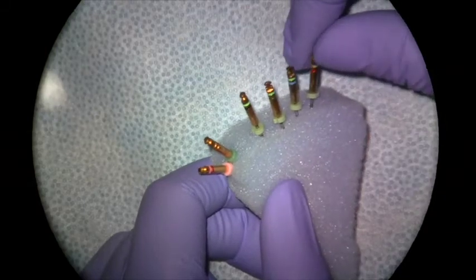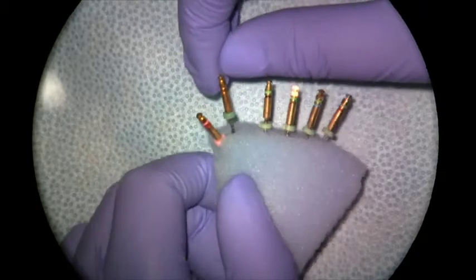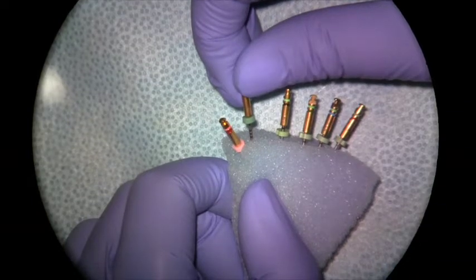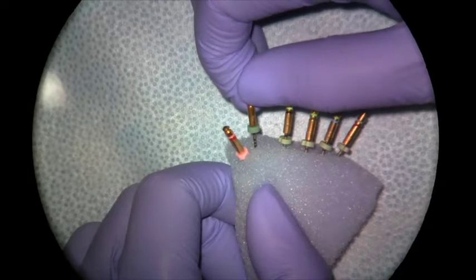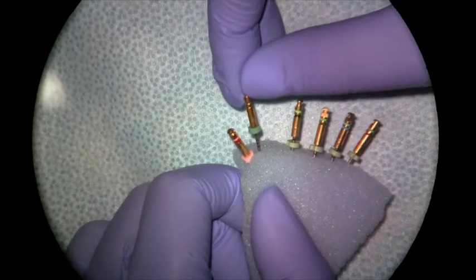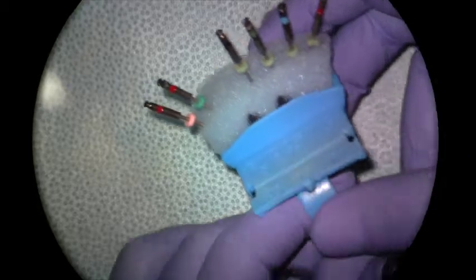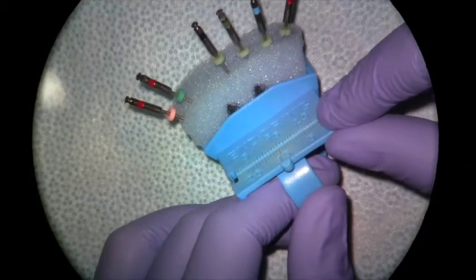If you're ever confused about what size a file is — for example if the color stripes have faded — you can always look on the handle itself on both the K3s and the K3XF. It will say both the taper and the tip size, so this one says 0.08 on the handle and 25 for the tip size. For our instrumentation demo we're going to be using the K3XF, but you could use the K3s in the same way.